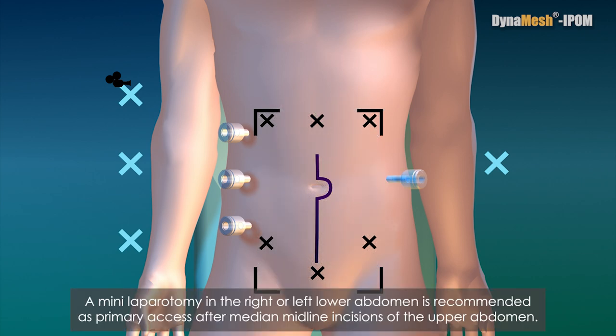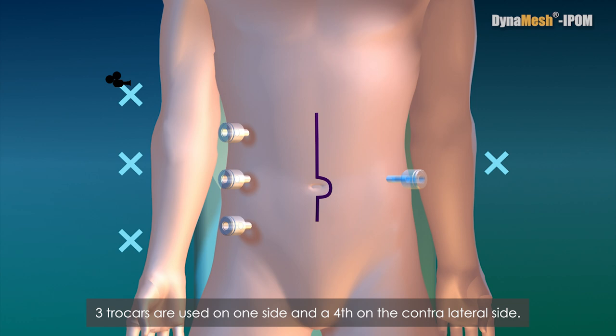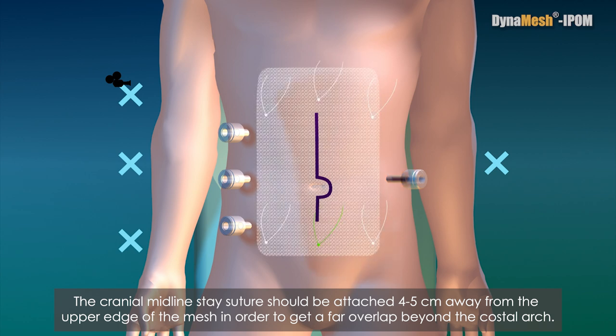A mini-laparotomy in the right or left lower abdomen is recommended as primary access after median midline incisions of the upper abdomen. Again, three trocars are used on one side and a fourth on the contralateral side. The cranial midline stay suture should be attached 4-5 cm away from the upper edge of the mesh in order to get a far overlap beyond the costal arch.